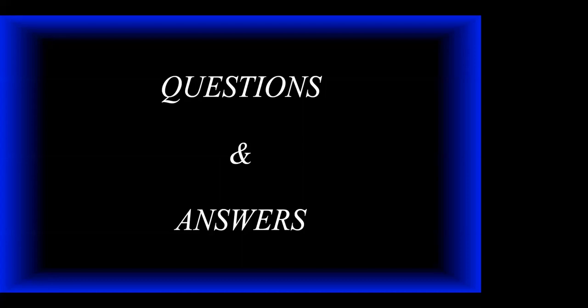When placing an implant in a molar site next to an existing implant, would you rather compromise distance between implants or use a narrow 3.6 to 4 millimeter implant for a molar site? Let me answer that the best I can, because I'm not actually sure I know what you mean. Well, what I believe they're asking is, can you use a smaller diameter implant in a molar site?